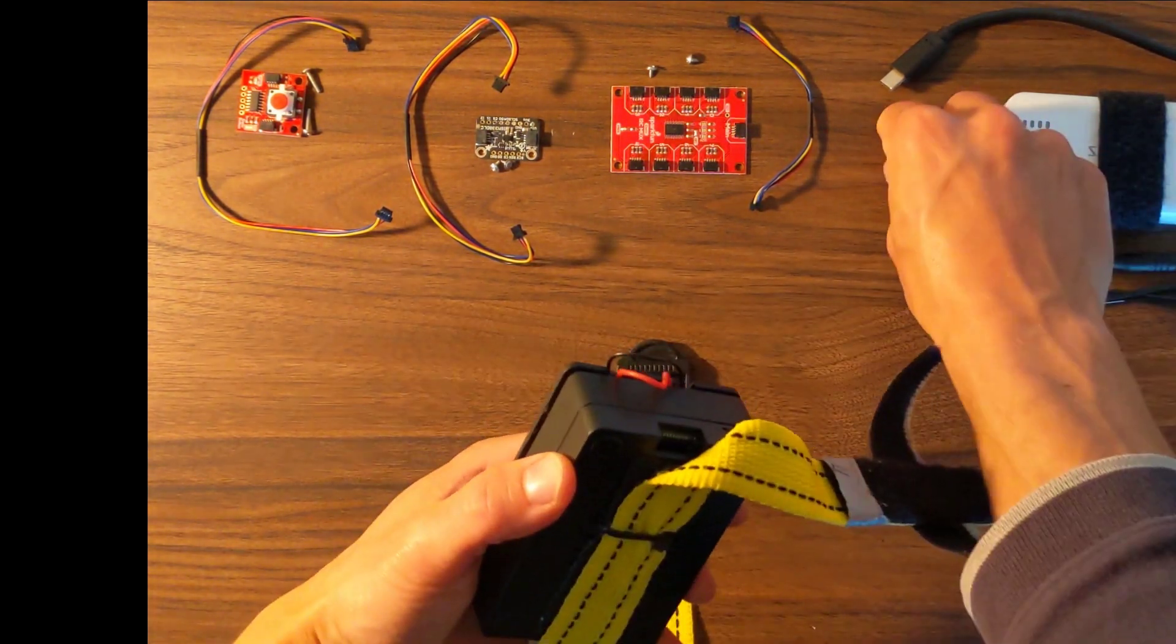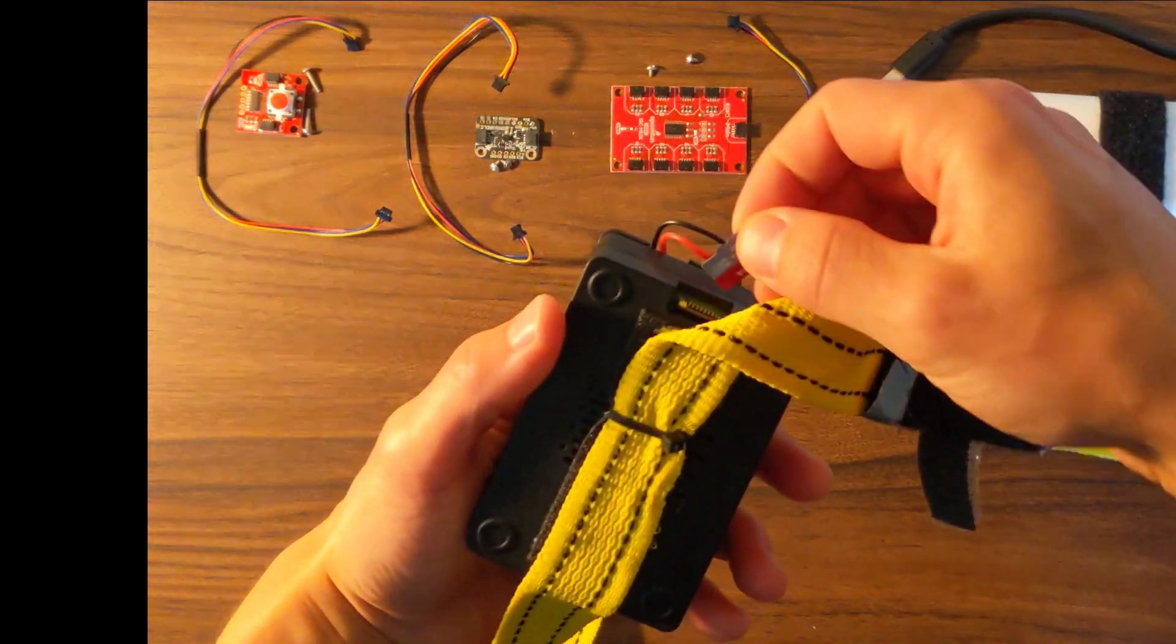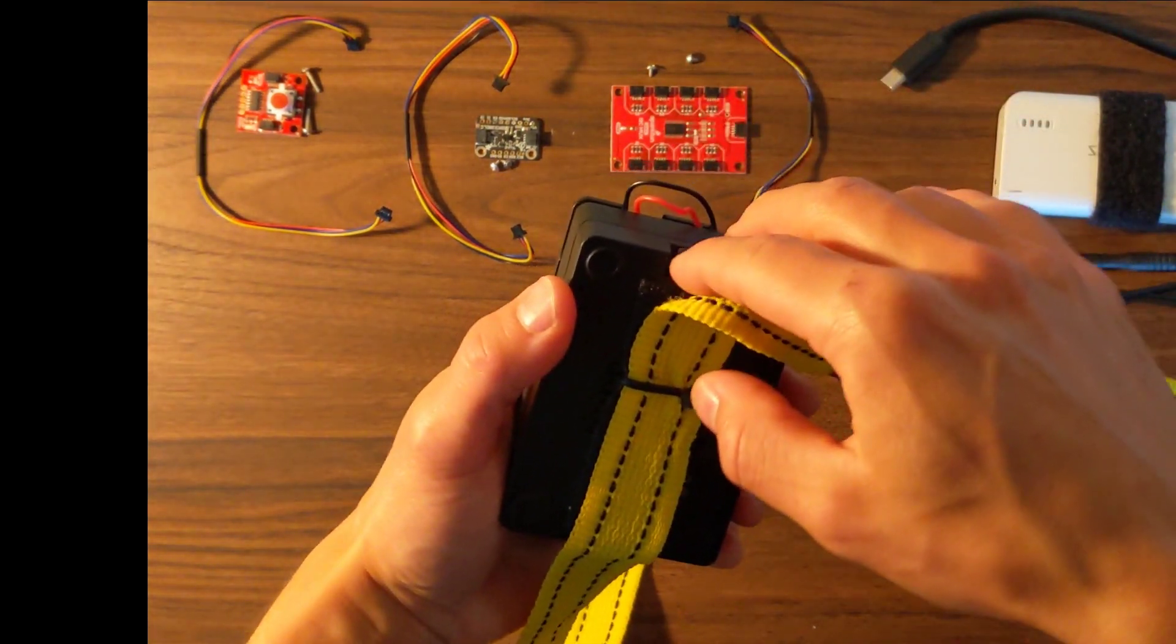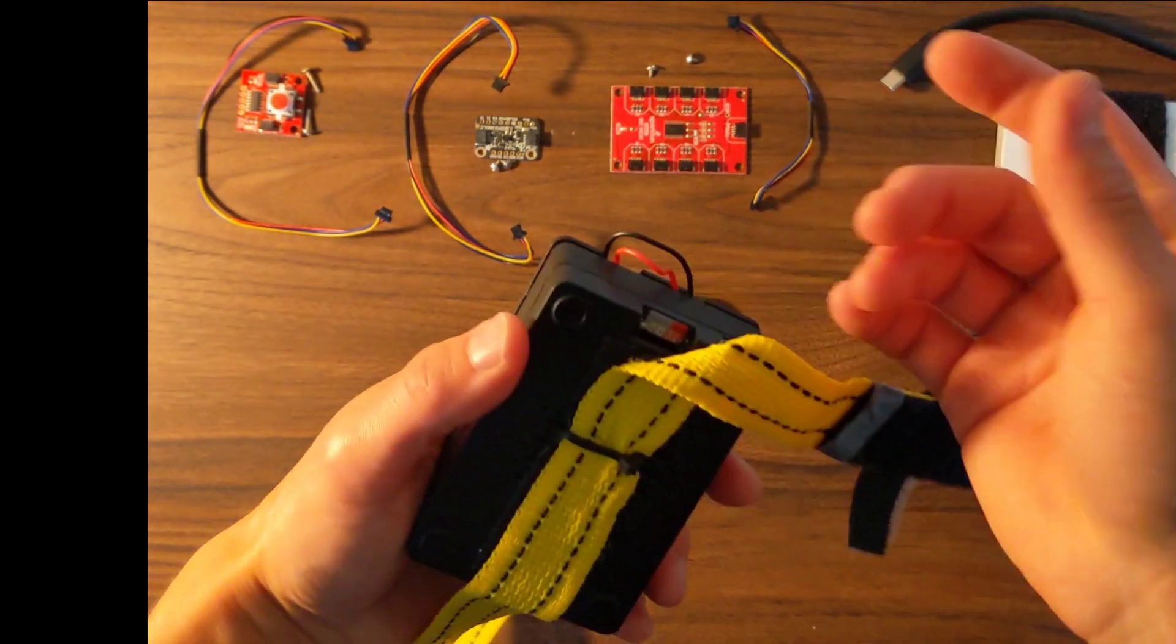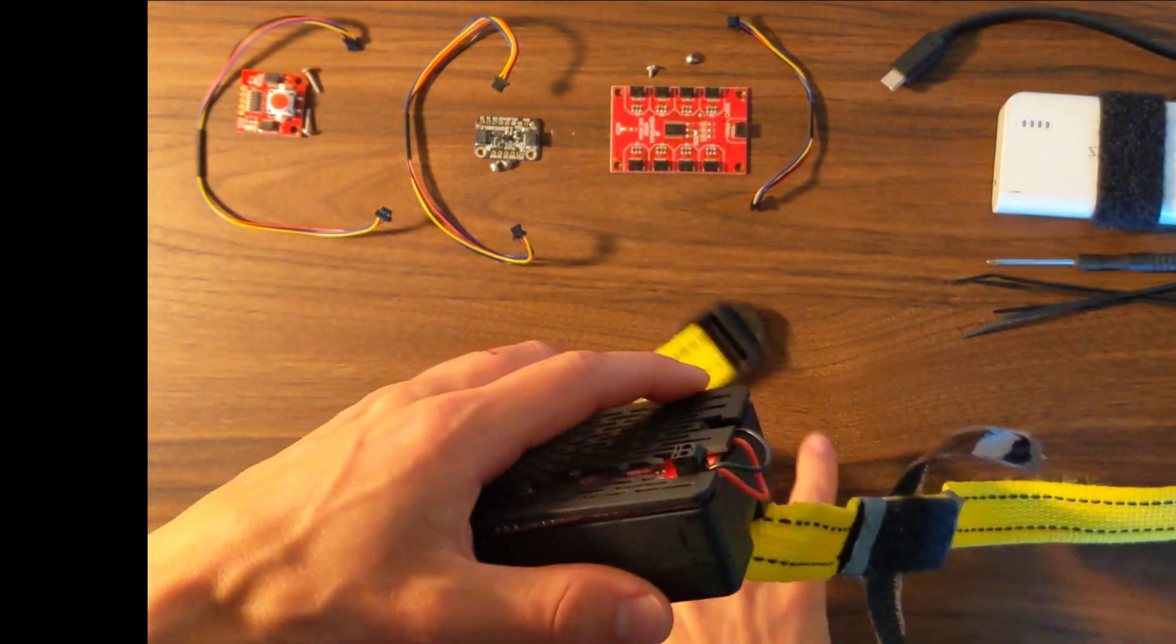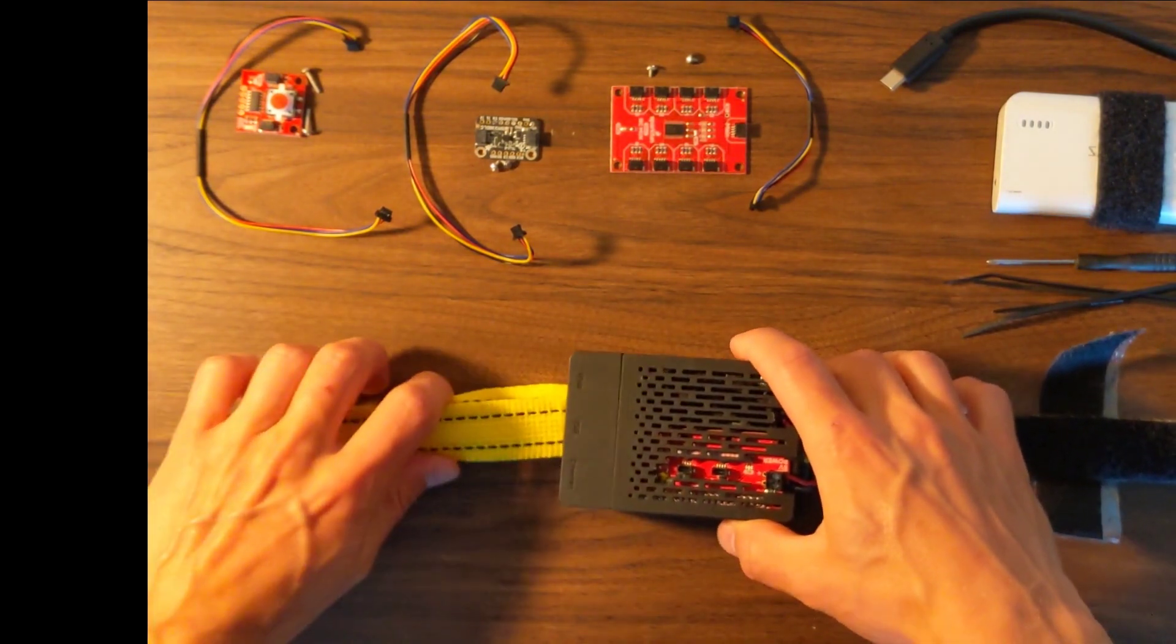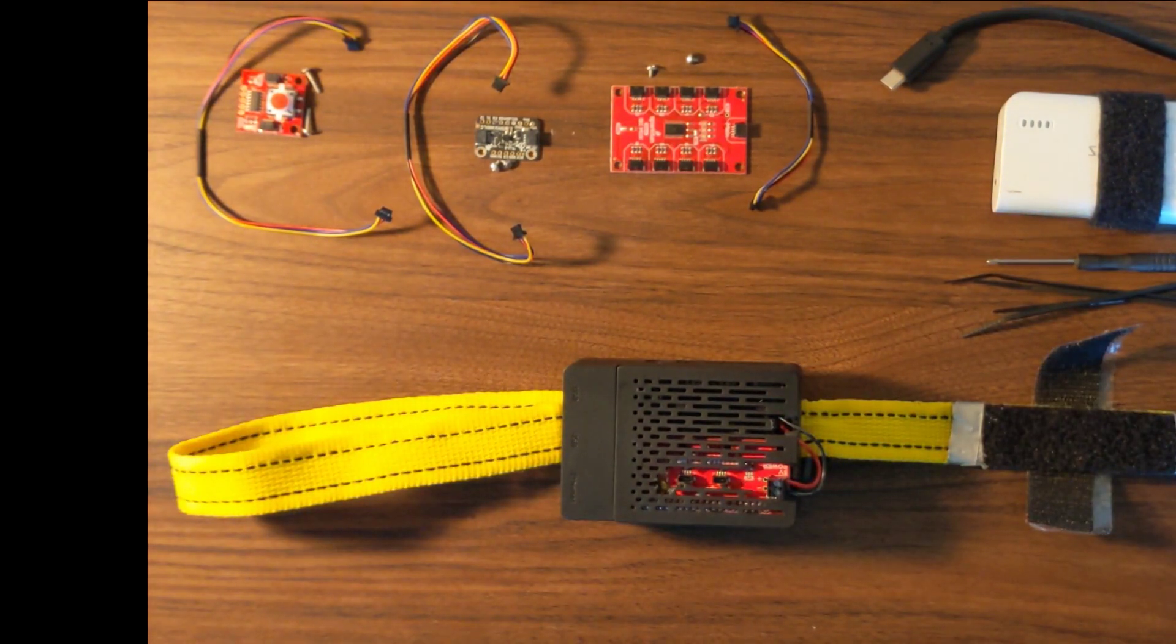Now we can actually stick in our SD card into this slot. Although we'll have to program that so you may want to leave that out until we've programmed it. And now we can attach the final pieces to the lid.